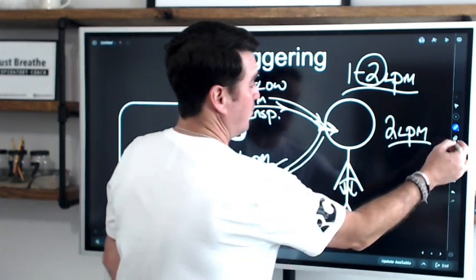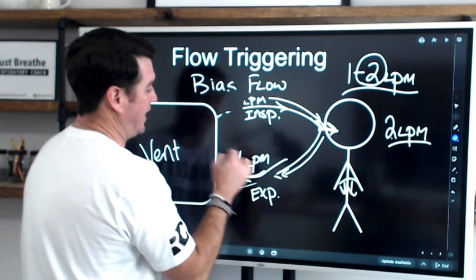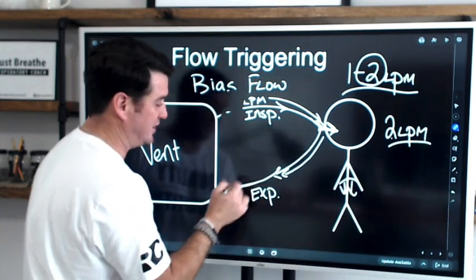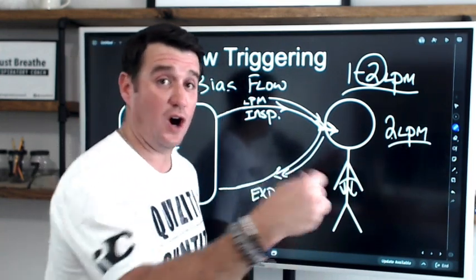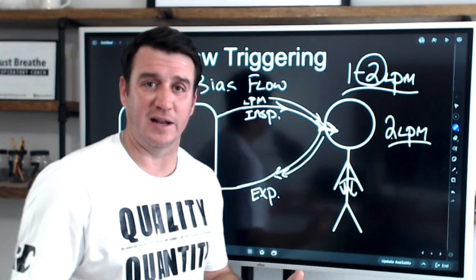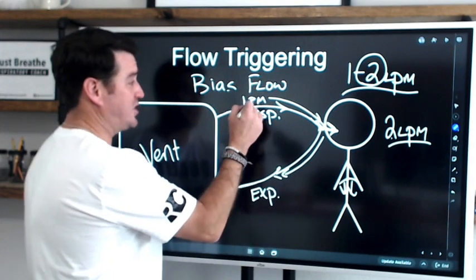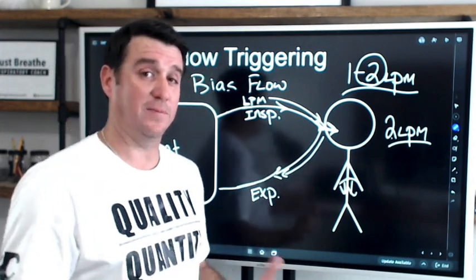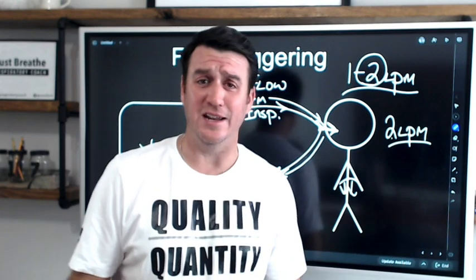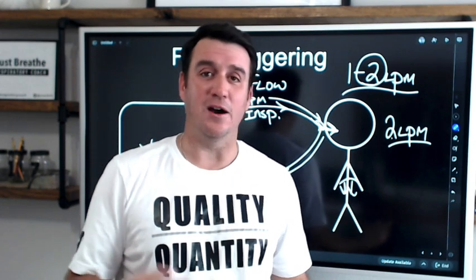This is also why, when you look at some ventilators, I think for the most part we've kind of gotten away from this, but there are some facilities who are still utilizing small volume nebulizers run off of the flow setting from the wall, from the flow meter, into a vent circuit to aerosolize albuterol or levalbuterol or whatever it is we're aerosolizing these days. Okay? So let me show you how this happens, because if you've seen this and you know what I'm talking about, you have a patient on CPAP, they're breathing just fine, they got a respiratory rate of 12, their tidal volumes are 500, they look perfect, we're going to be getting them extubated soon, and then you give them a breathing treatment and they go apneic.